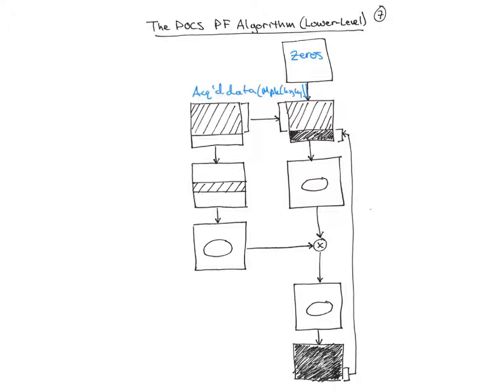So this replacement step is projector 1. And then that gives you your estimate of the image, which we'll call m of kx, ky. The more darkly shaded region here is the part of k-space that's going to be filled in by the algorithm as you go. But at each step, after filling in the data, you take the inverse discrete Fourier transform. That gives you an image estimate corresponding to your current k-space data estimate.